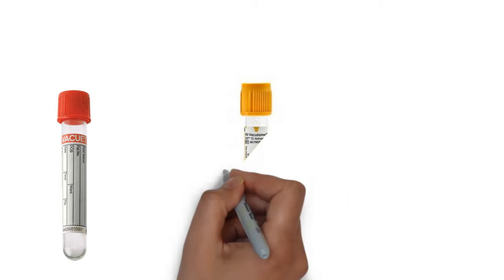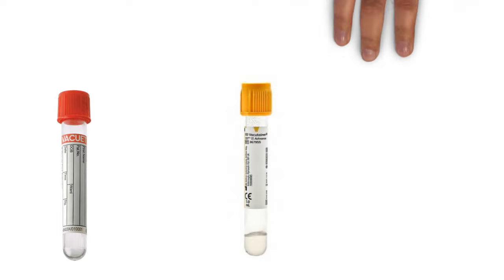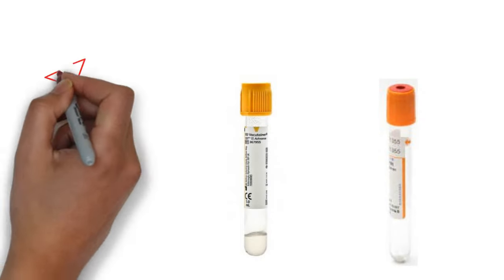For that you need vacutainers that do not contain any anticoagulant. You can use a red top vacutainer, yellow top vacutainer, or orange top vacutainer to prepare serum.